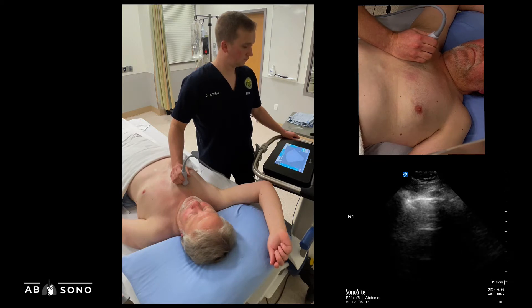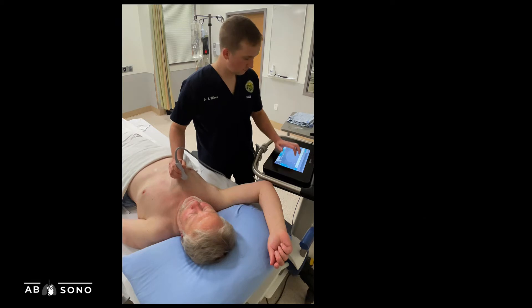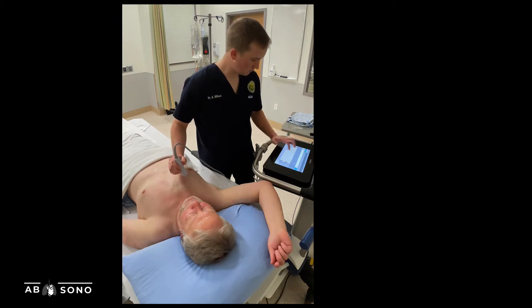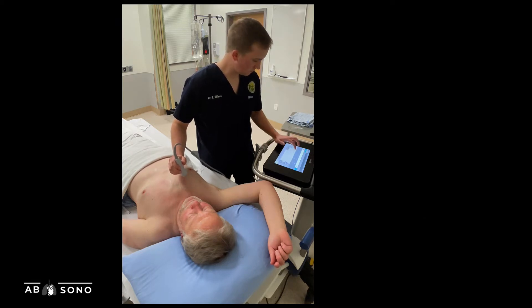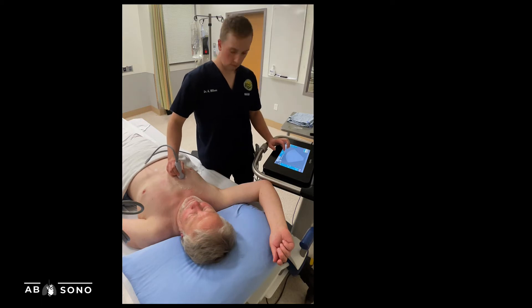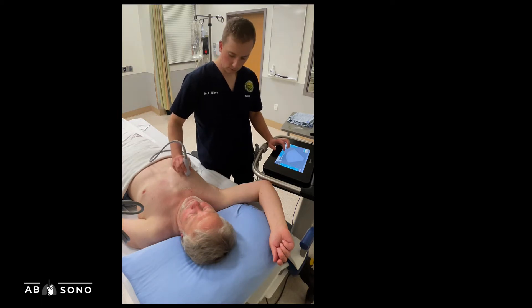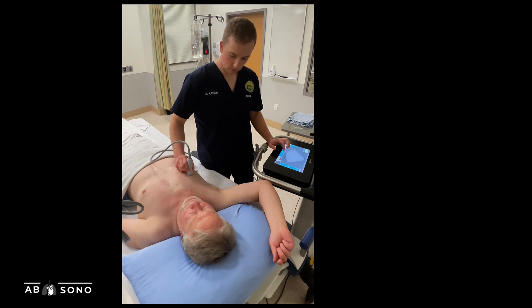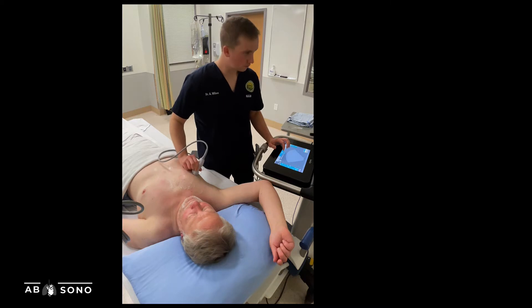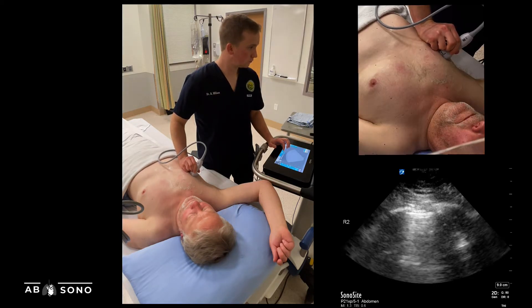The next point to image is zone 2, which should be labeled R2 or L2 when recording clips. This is obtained by placing the probe at around the fourth or fifth intercostal space at the anterior axillary line. The starting depth is also around 10 cm.